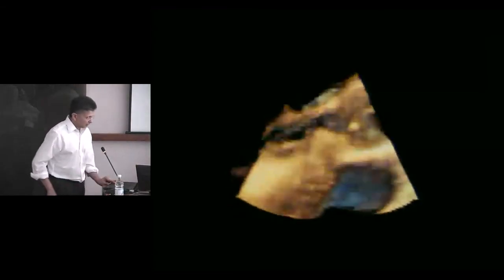This is a different patient with subaortic stenosis. This is the TE that we did. He was a big guy, 120 kilos. We weren't really able to get any surface images on him. We had some concerns about the mitral apparatus and so on. And here you can see this is very impressive, severe tunnel type subaortic stenosis. The valve itself looks okay, but this is long and ugly.